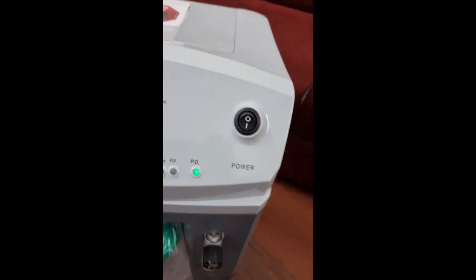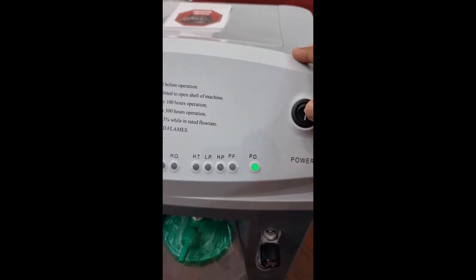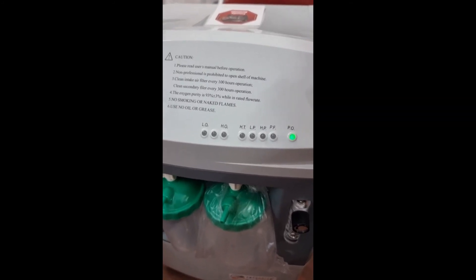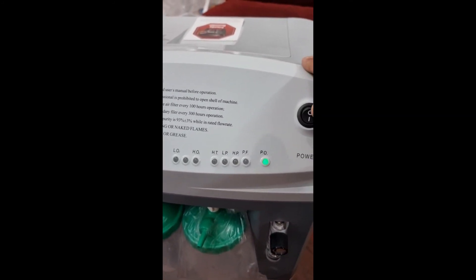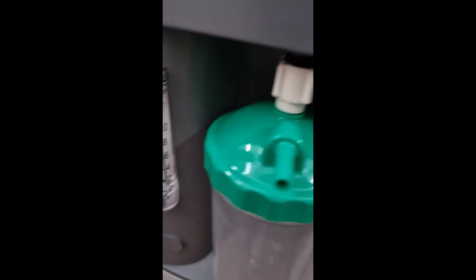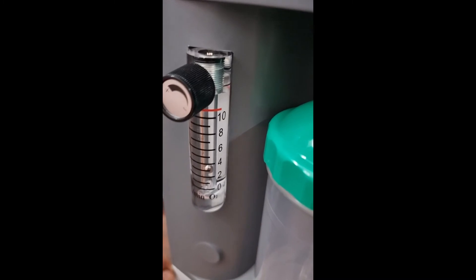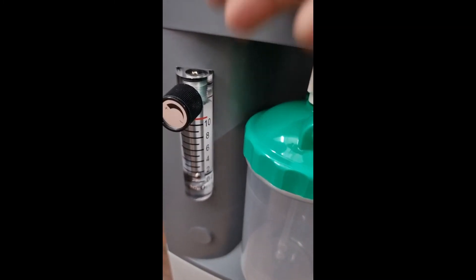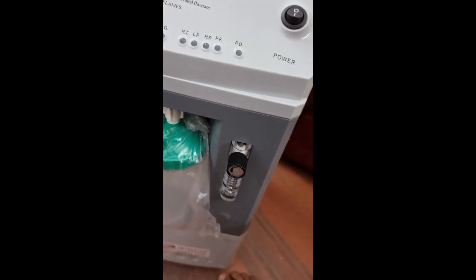Now we will switch off the device. Every 8 hours, try to give the machine a rest of at least 20 minutes — that is the correct usage pattern, and following it will make the machine last a long time. Switching off is simple — just switch off, no need to adjust the flow meter. The ball will automatically drop to zero. When you switch on again, the last settings will be restored.